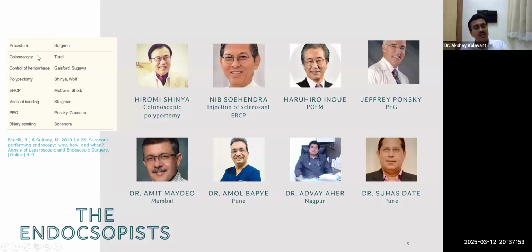If you see, many of the contributions are all from surgeons. Whether it is colonoscopy, Dr. Turrell suggested how to design a colonoscope. For control of hemorrhage, it is Gasford or Sugawa. In the previous era, people wouldn't dare to do a polypectomy because of a very high chance of bleeding. So it was Hiromi Shinya, a Japanese surgeon, who devised the snare and used electrocautery for removal of the polyp.